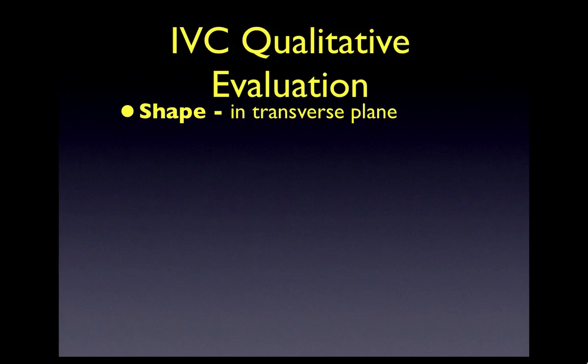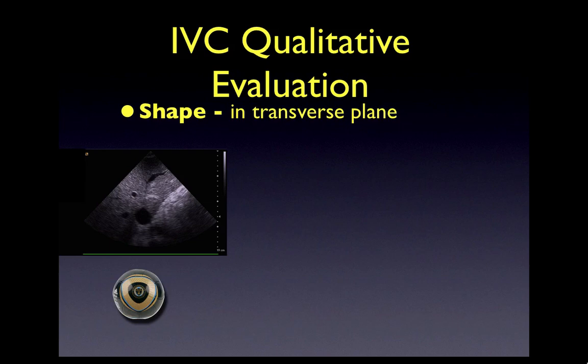When we're evaluating the IVC, what are we looking at? So first we're actually doing just that. We're looking at it. The first evaluation is a qualitative one. We're looking at the shape of the IVC. There are some trends in the shape as they relate to volume status.